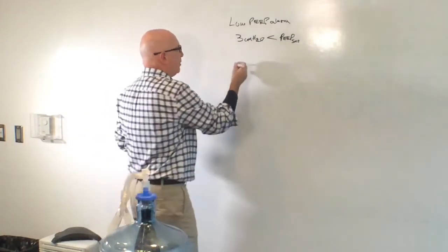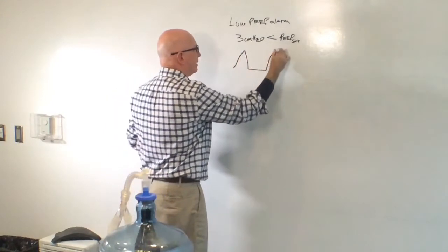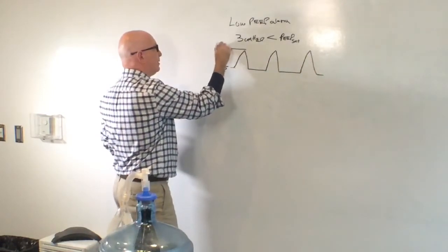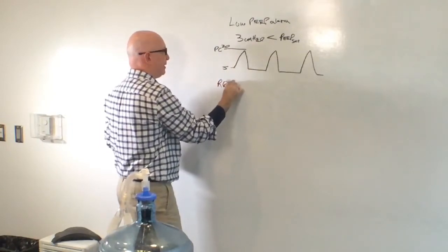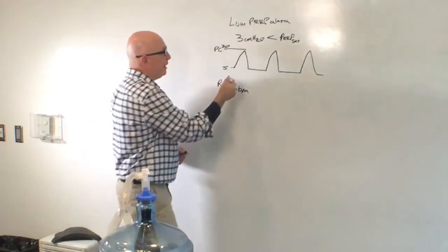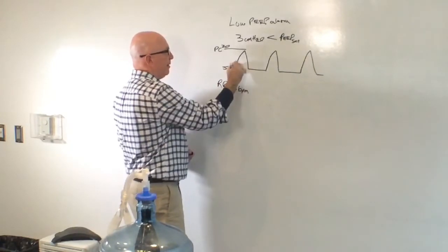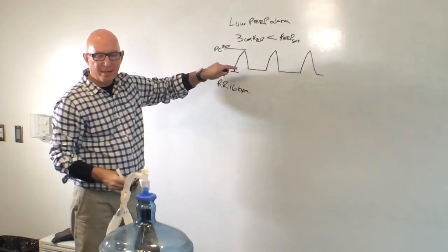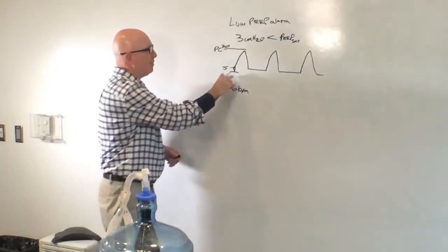And if you were to look at a pressure waveform, if you had these actually available to you. So let's say that your PEEP is set at 5 and they're on pressure control of 20. And let's say the patient's on a respiratory rate of 16 breaths per minute, and they're breathing along with you at 16 breaths per minute. So it is possible that when the patient triggers the ventilator, their inspiratory effort is great enough that the LTV doesn't respond quick enough to spool up its turbine to get the flow into the system to make up the flow that the patient wants.